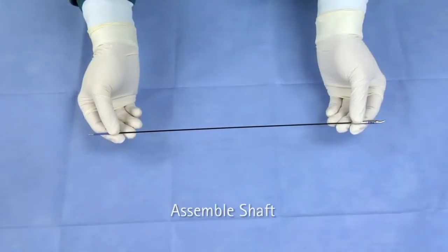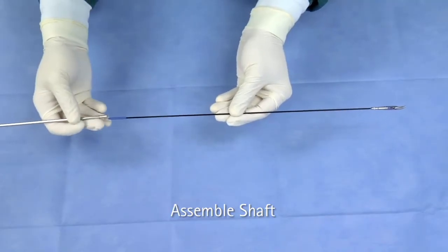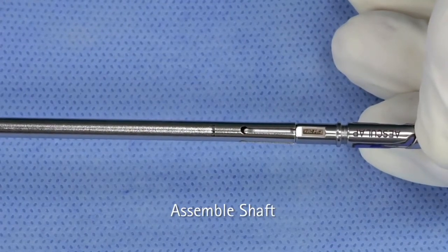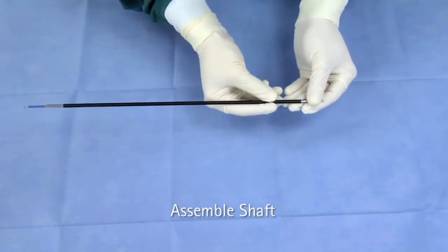To assemble the Sovereign Bipolar Laparoscopic Instrument, first slide the inner metal tube onto the jaw insert with its four spring tongues toward the working end until the tongues snap into place. Next, slide the outer insulation tube as far as it will go over the inner metal tube.